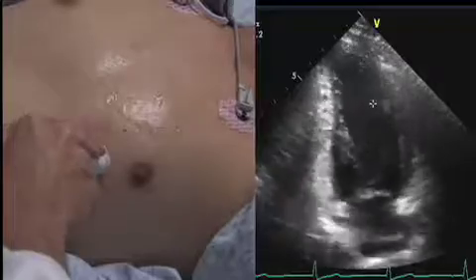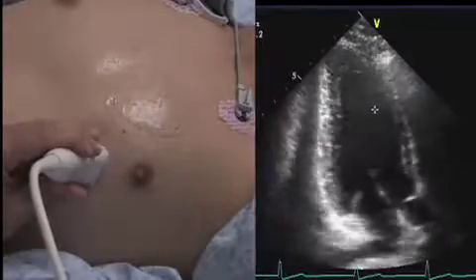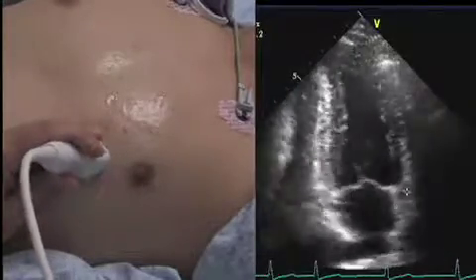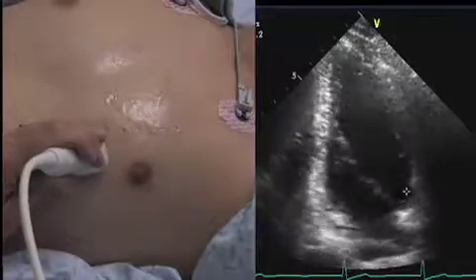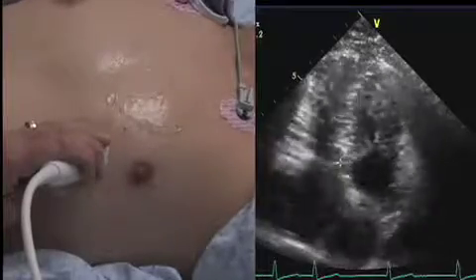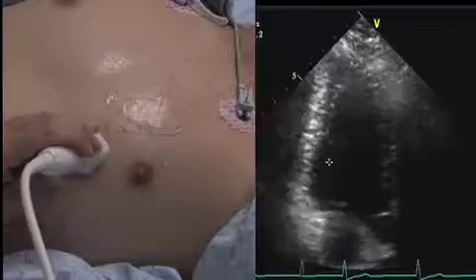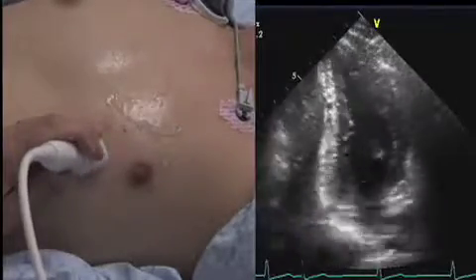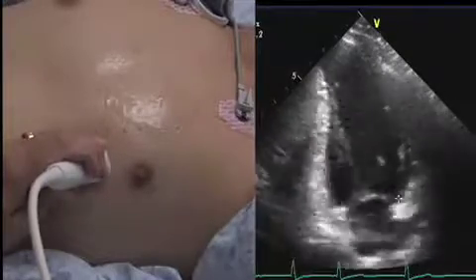Now, if this is a difficult view, it's often very helpful to go ahead and rotate all the way to see the aorta come in — now we know we've over-rotated for the two-chamber. And if we rotate back a little bit, now we know this has got to be the right place. If I'm under-rotated, I'm going to see the right ventricle coming in. So this is under-rotated and this is over-rotated. You just want to be right in the middle — no RV, no AO — and now we know we've got a good apical two-chamber view.